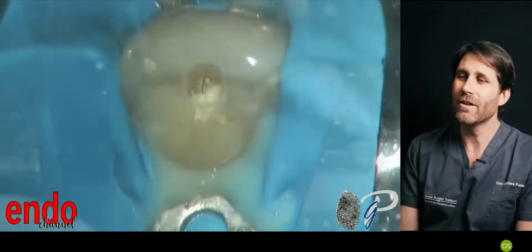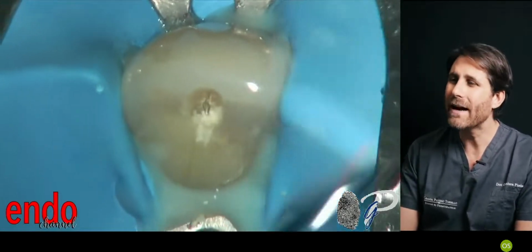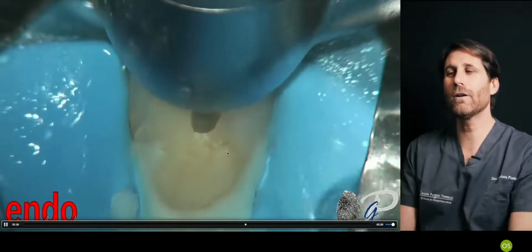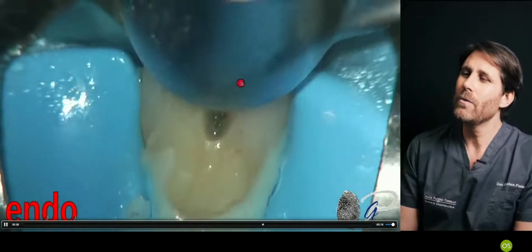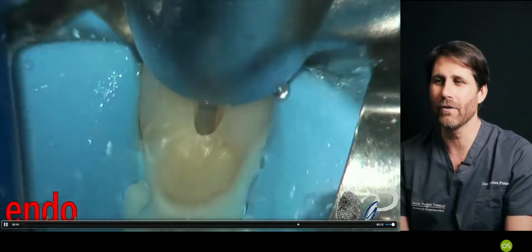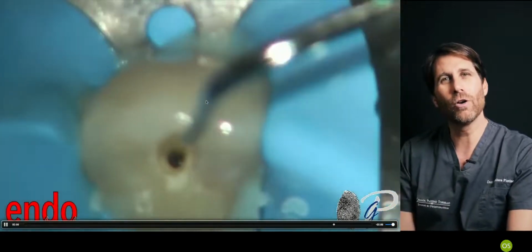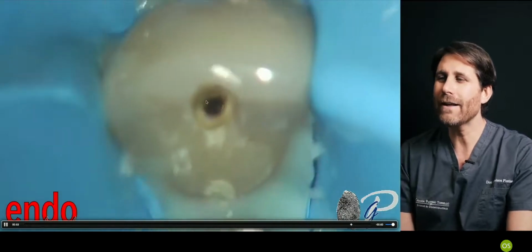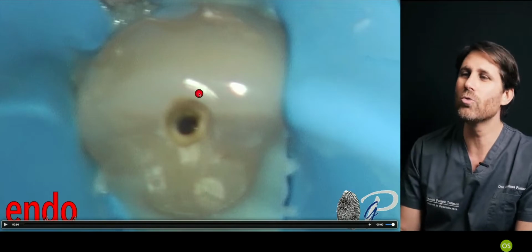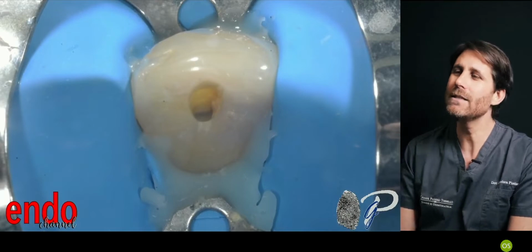Just go vertical, parallel to the long axis of the tooth, palatally to the incisal edge, while maintaining all the cingulum, which is the most resistant part of the tooth. We will see which burrs I like to use in all these cases, but mainly I use only one burr for this case. Just one burr to penetrate the pulp chamber, like this, in an orifice directed orientation, directed through the palatal portion of the incisal edge, that permits us to go inside the canal with this direction. And this is the access cavity.